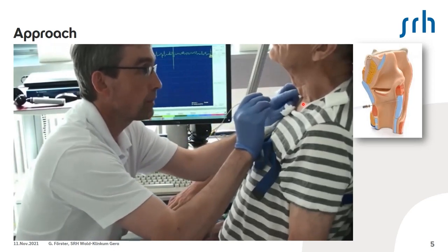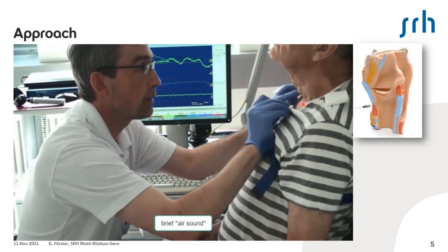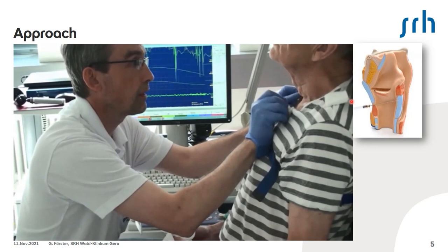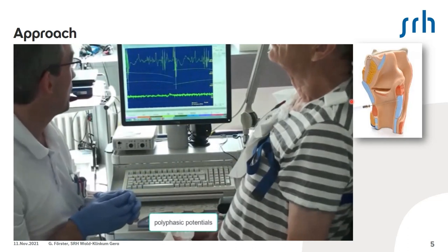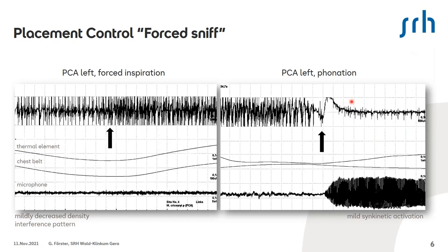Here, a demonstration of how we do PCA EMG. We've done all the local anesthesia. We go in at a very rectangular angle to the skin line, yeah? And if you have a male larynx, which is slightly upward, and if you have a female larynx, which is higher, then you go more horizontal, yeah? So it's very straightforward. And then, of course, you have to interpret the signals that you find, yeah?